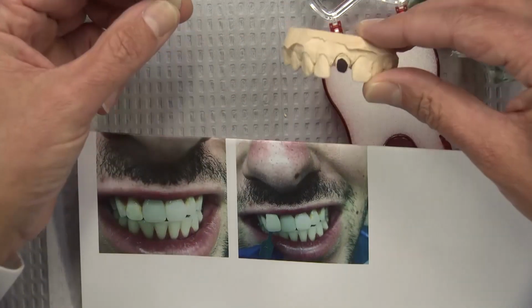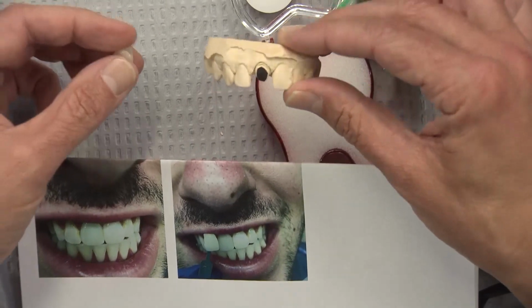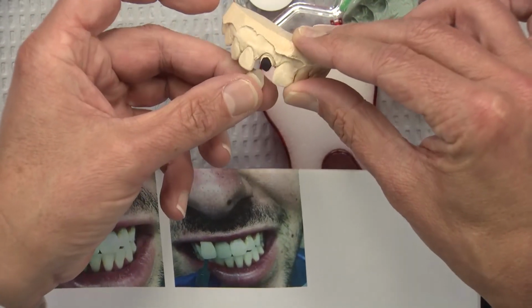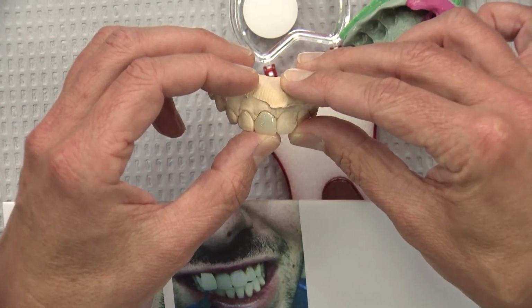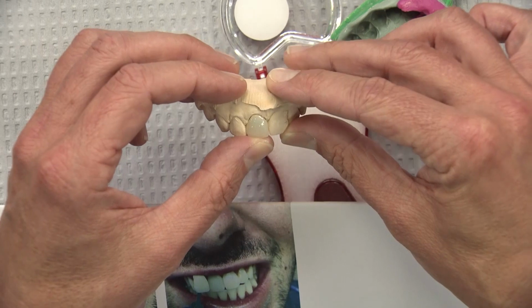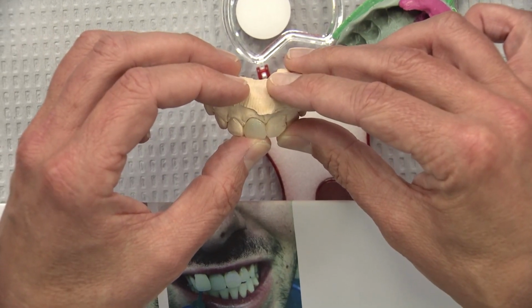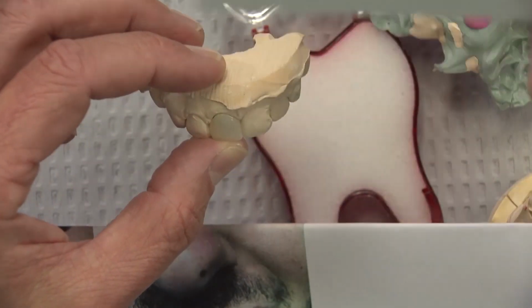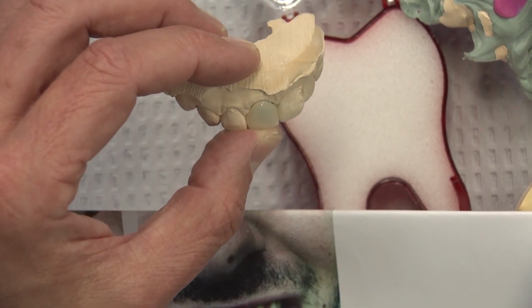And so I took this particular patient's solid model and put some black on there. And you can definitely see the difference when the crown goes into place, with that Sharpie in the background, how it really dulls and darkens things. It's one of those things that you really don't know until you try it in. But you can really almost see the prep outline showing through there when you look at it like that.